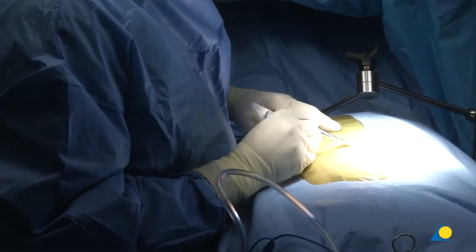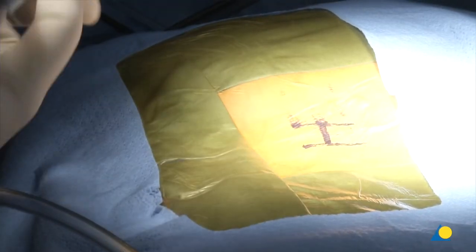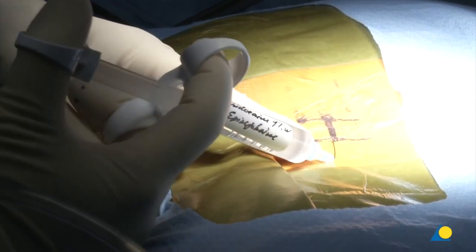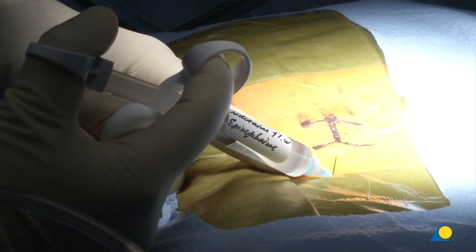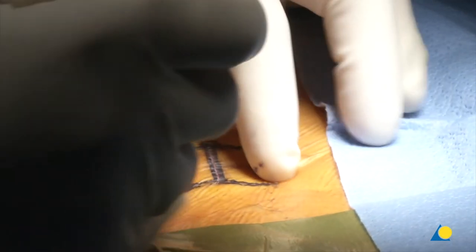We have marked the midline and marked an incision to the right of the midline approximately one centimeter. Typically we inject right under the skin just for hemostasis — a little bit of lidocaine with epinephrine. We'll make a small incision here, going very superficial, making it about the right size for an 18-millimeter tubular retractor.